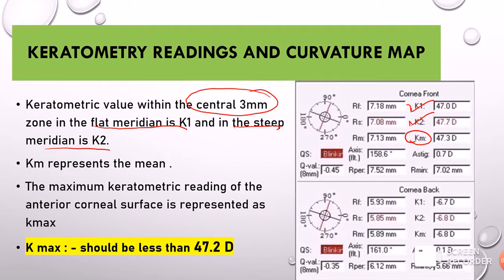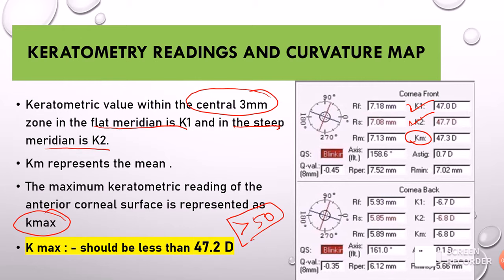Then we have another reading called K maximum. The maximum keratometric reading of the anterior corneal surface is represented as Kmax, and this Kmax should always be less than 47 — to be exact, less than 47.2. Whenever Kmax goes beyond 47 to 50, it becomes a moderate risk of keratoconus or ectasia, and whenever it is more than 50, it is definitely a very high risk of keratoconus or corneal ectasia.